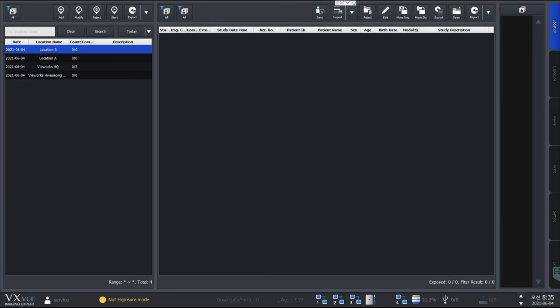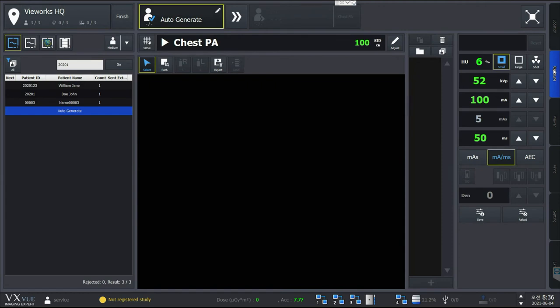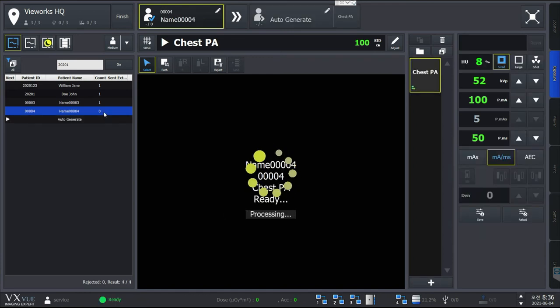Vehicle mode is specialized for conducting X-ray examinations inside a vehicle. While most of the functions are similar to the general version of VXVue, it has some specialized functions as well. First, it registers and manages the prescribing information based on a place or institution where X-ray exposures are made. In other words, VXVue vehicle mode is customized for working with a bulk of X-ray images by location. Simply register a location before X-ray exposure and prescribe information for each location. You can search and add studies from the exposure mode using a barcode reader. Another convenient feature of vehicle mode is that VXVue automatically registers the next patient when an X-ray exposure is made.